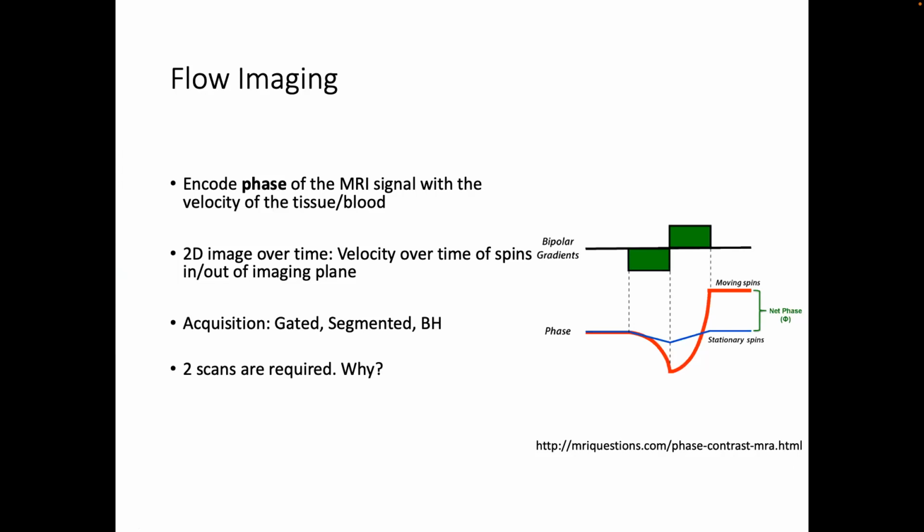Okay. So let's look, we're going 15 minutes. This is a totally cool part of MRI. If you really want to know more about MRI imaging, I would pick this as something to spend some time on, because it's great. Remember we talked about positive and negative signals and reconstructing phase angles. This uses the phase of the magnetization vector to determine if it's moving while you're imaging.